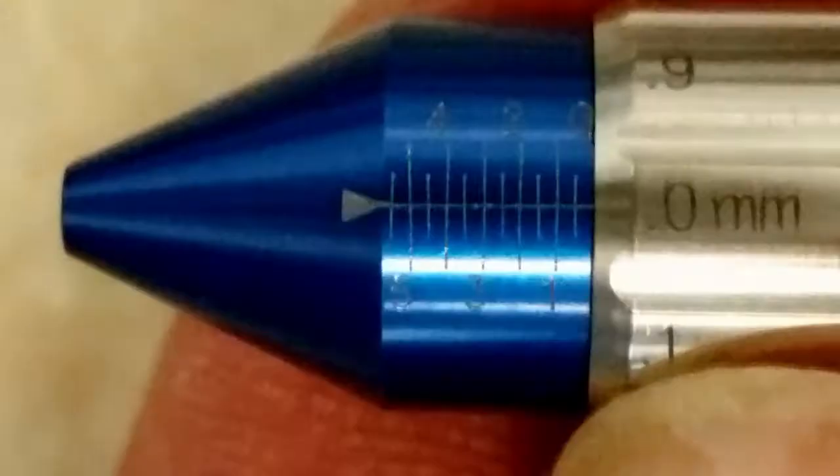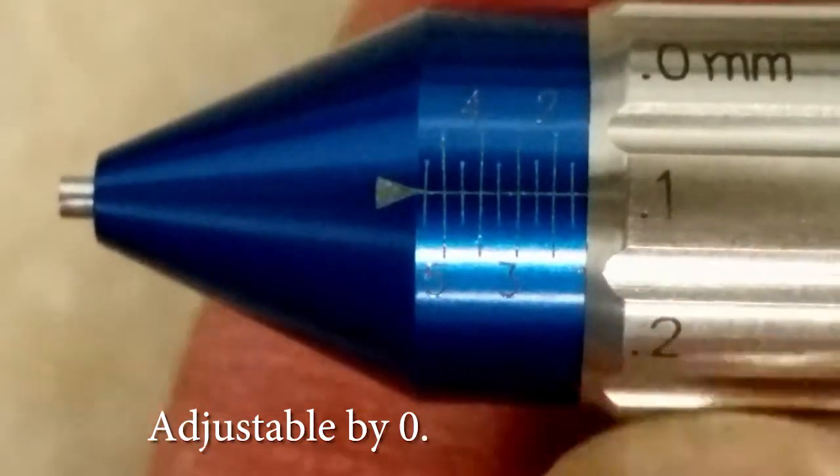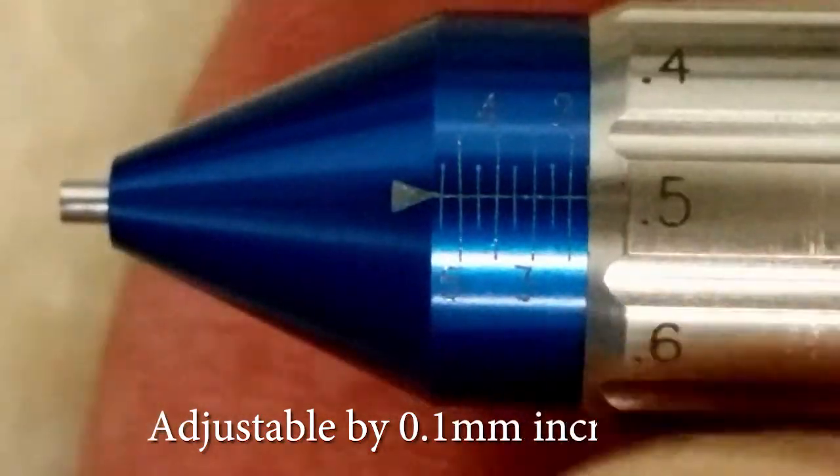Our new nose cone for the Vortex is adjustable by 0.1 millimeter increments. This is the most precise depth control system in the world. As you know, a variation in depth of 0.1 millimeters can make all the difference in the world.